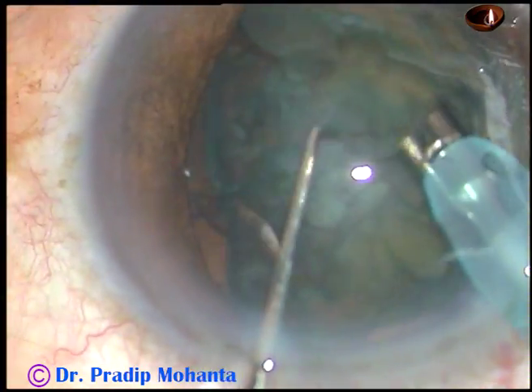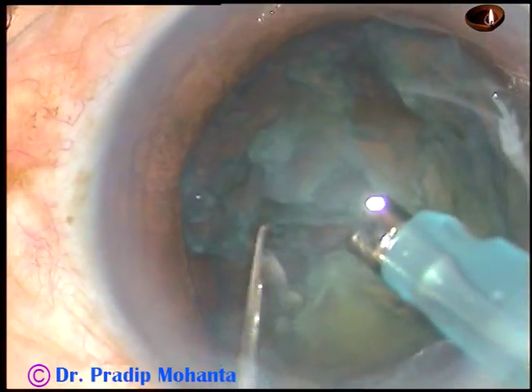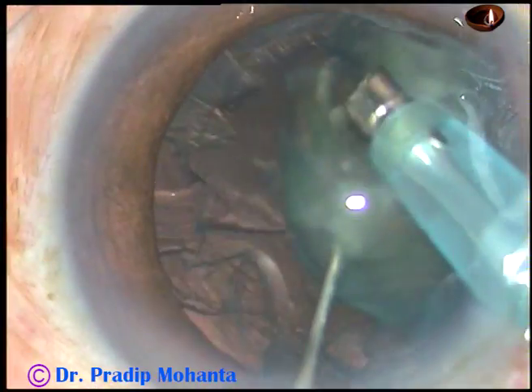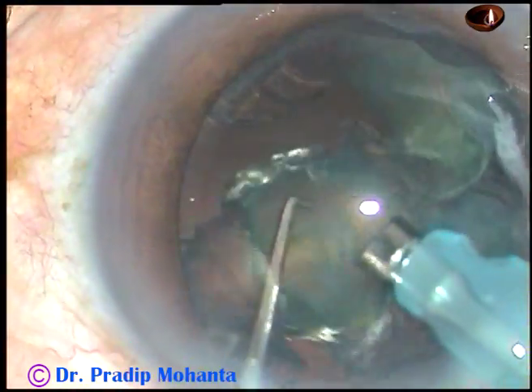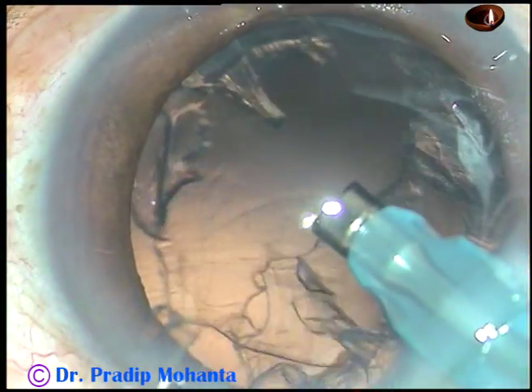The whole lens is being managed. It has been divided into two parts, and in a very short time the whole nuclear mass is emulsified and taken out.